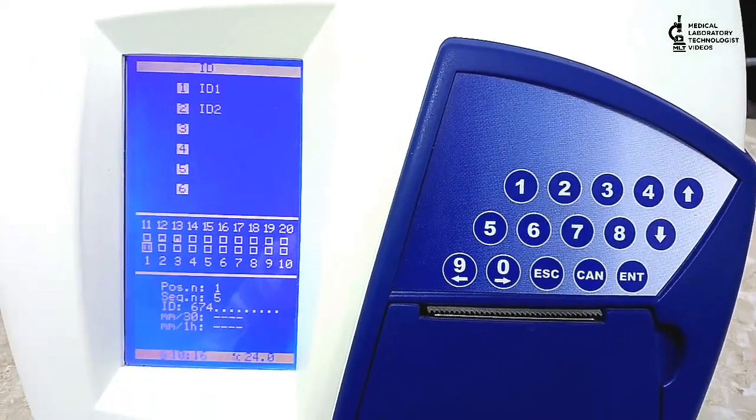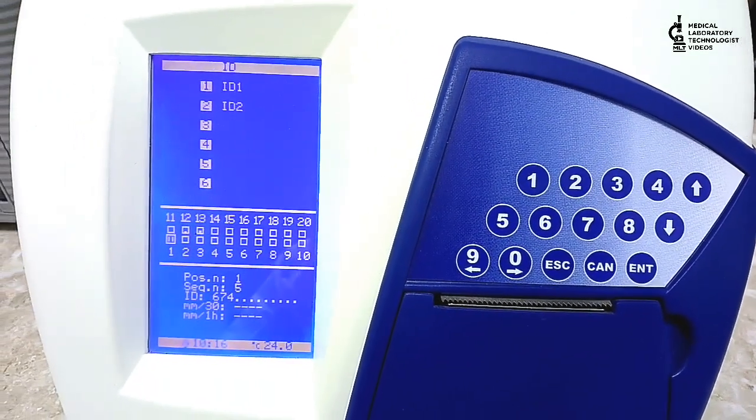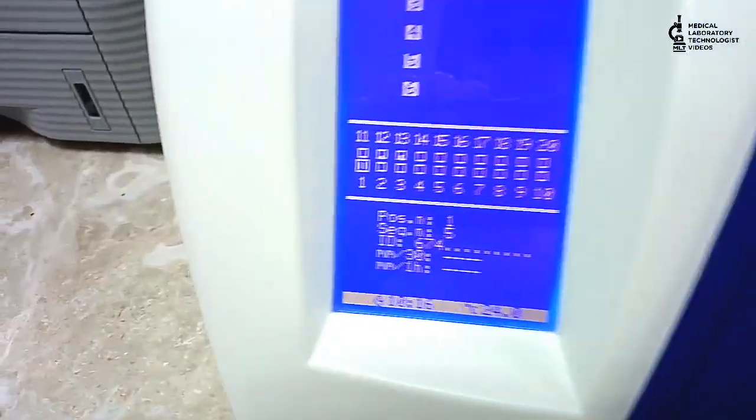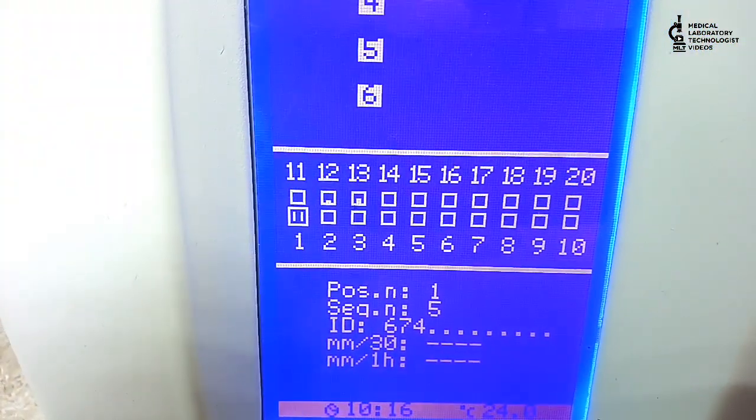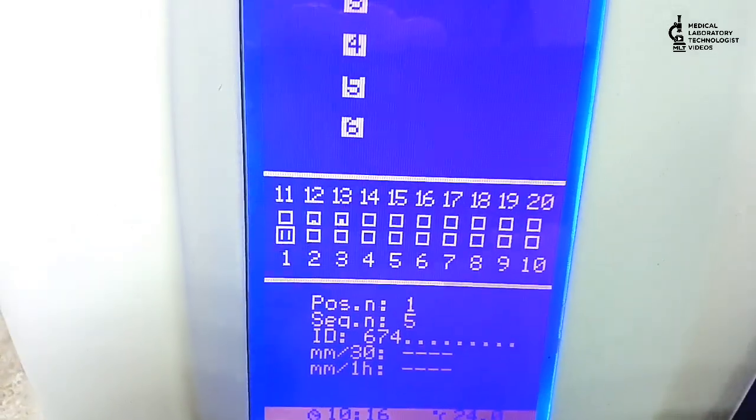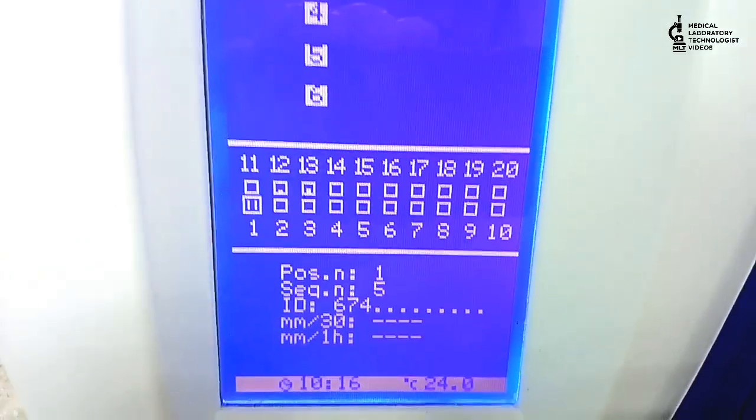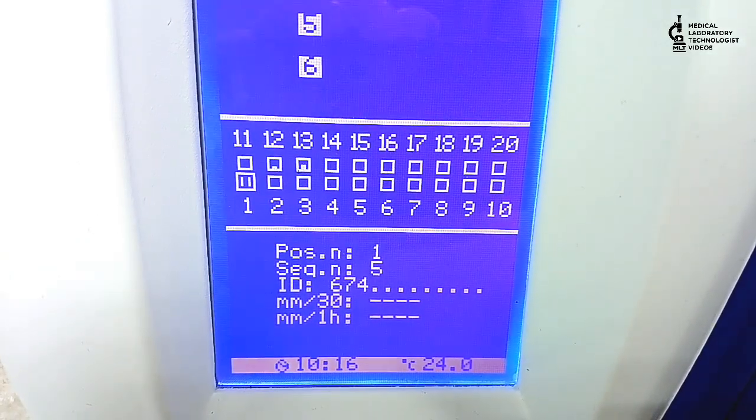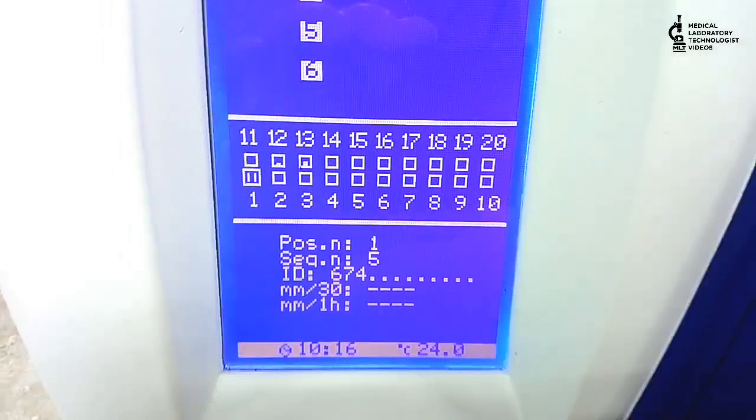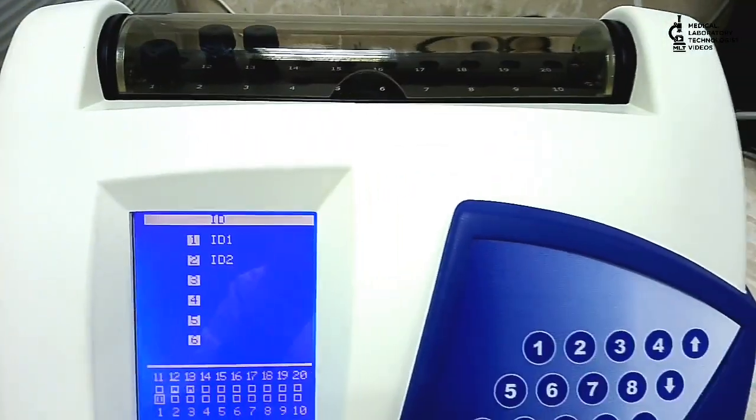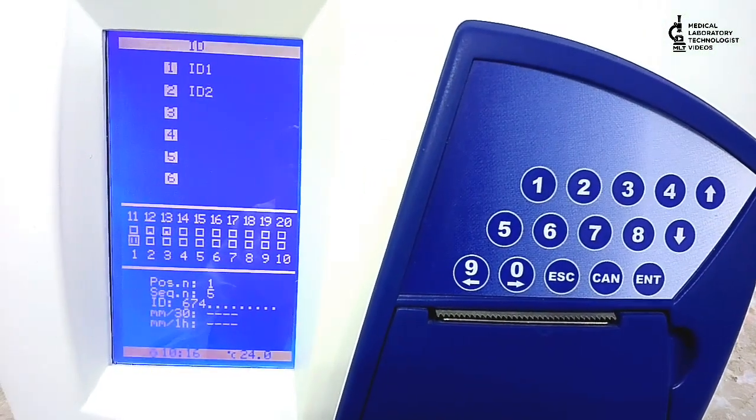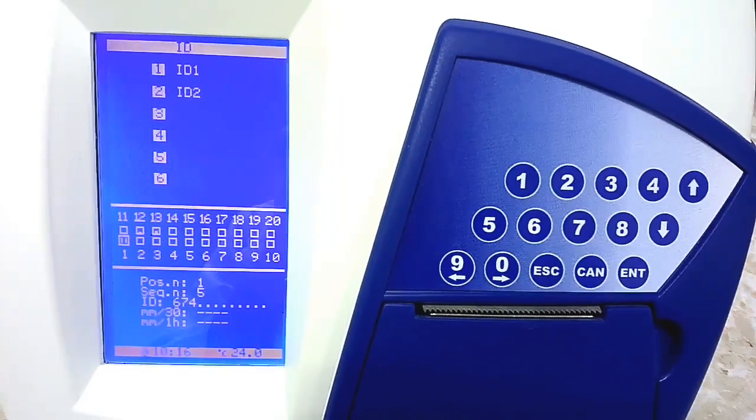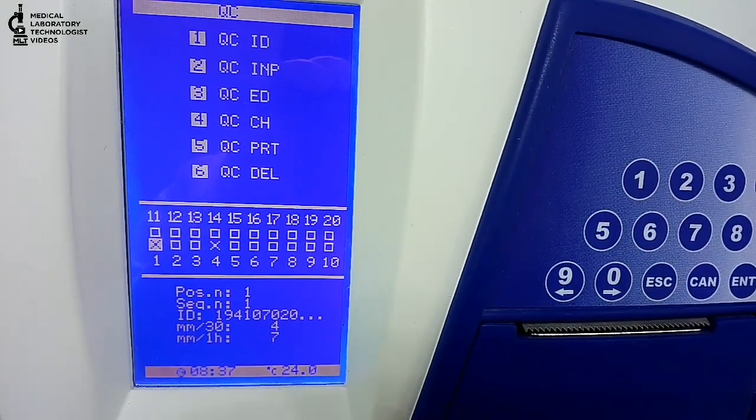This is the machine in which you can run automatically ESR samples. It is very easy to handle this machine and very good in function also. You can use it for long-term purpose. There is no special maintenance.